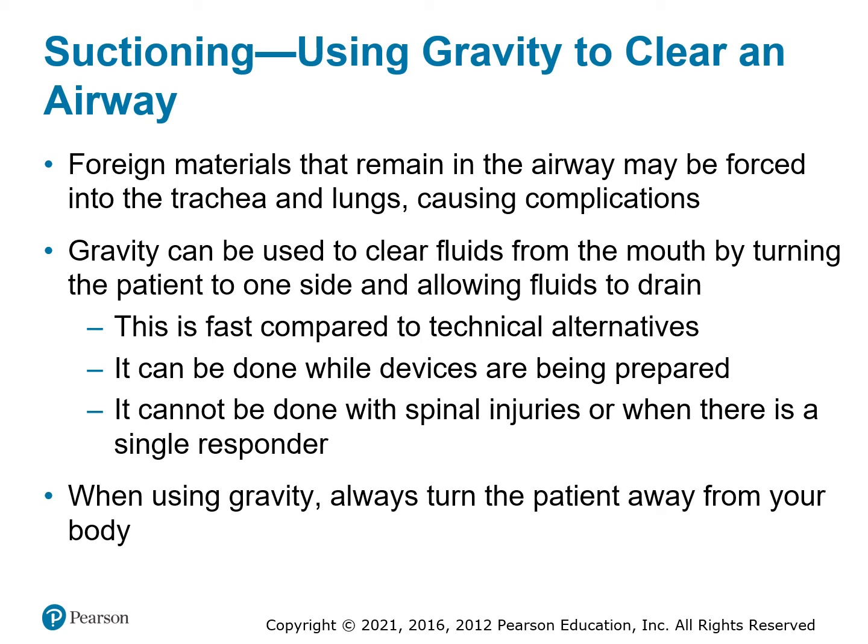If you're using suction, try to clean your tubing out. The biggest thing is, you start sucking out, you're getting all in there, and you get gunk in that tubing, and when you want to use it again, that gunk is now dried and blocked your suction tubing. So you want to make sure when you do suction, you have some sort of water next to it, some sort of clearing to be able to clear your tubing out.